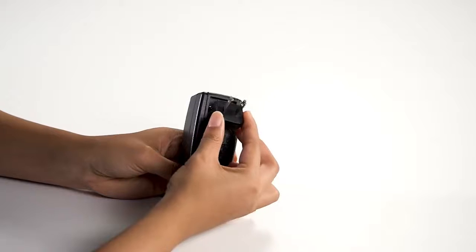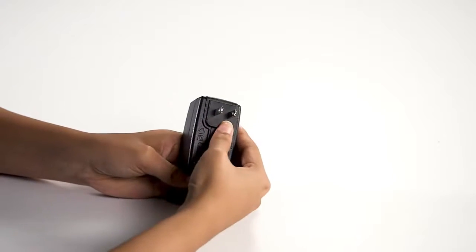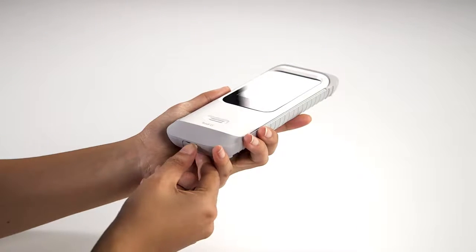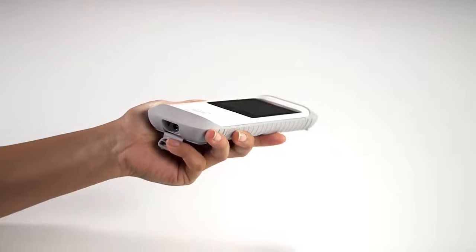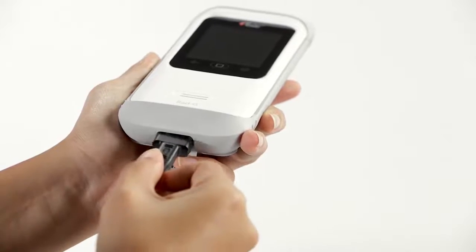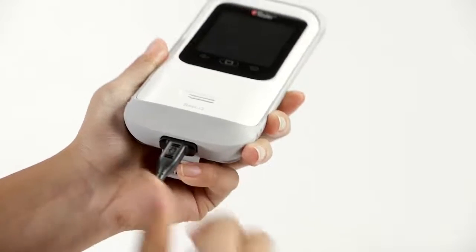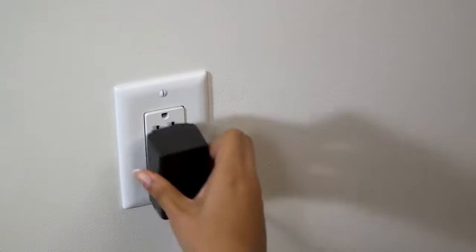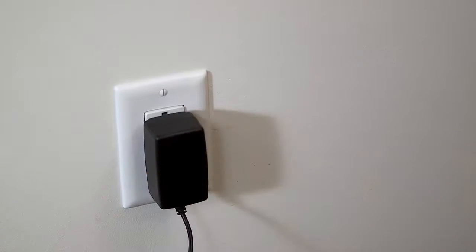Insert the tip of the appropriate plug assembly insert into the power supply at a 30 to 60 degree angle. Plug the AC power supply cord into the bottom of the RadG device. Verify the plug orientation is correct during connection.